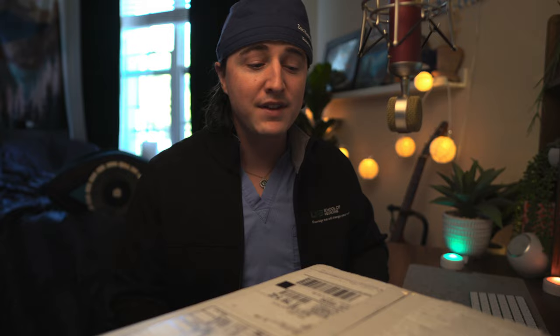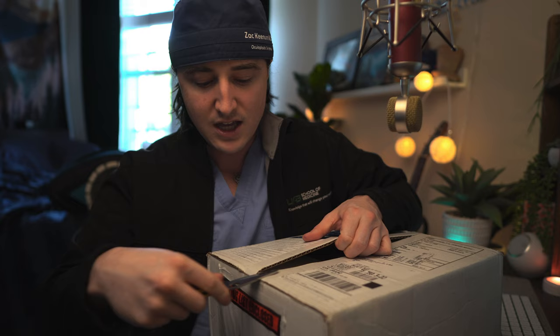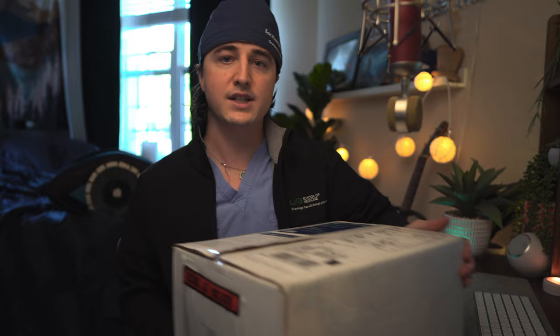In today's video, we are doing an unboxing. I'm not going to draw this out like those long unboxing videos you see for tech YouTubers. We're going to cut it open and get to the meat of this. So while I open it, let me tell you who this is from — a company called Oroscoptic.